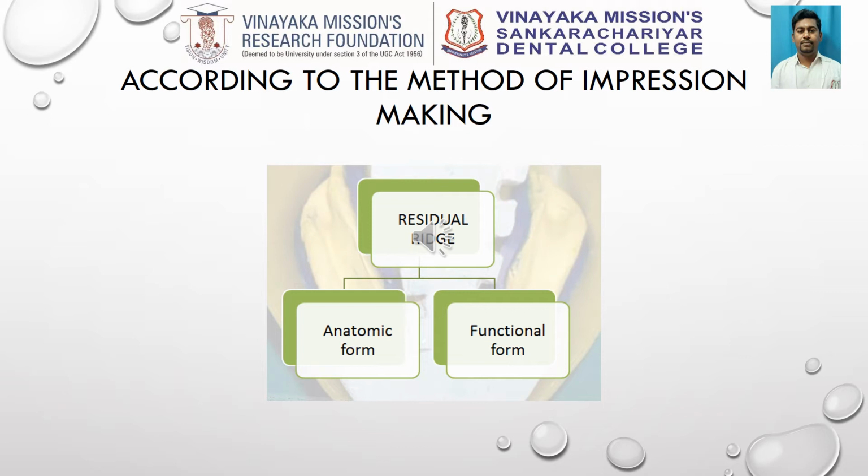So what is the advantage of taking the impression of the residual ridge in a functional form? First, we will have uniform support, and there will be an equalization of resilient and non-resilient tissue support.